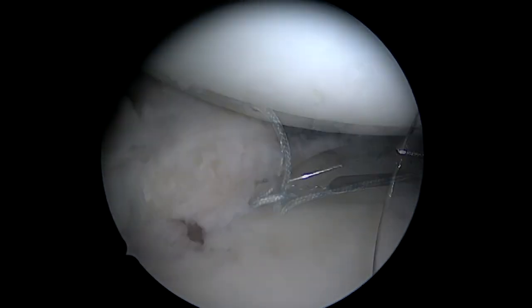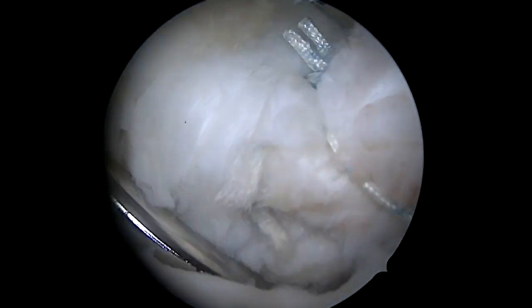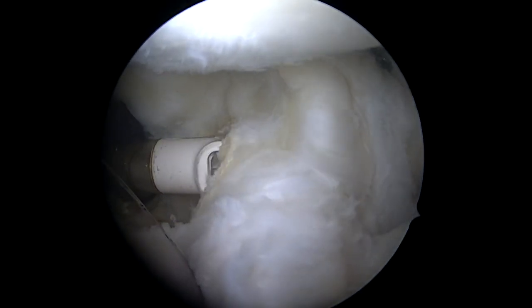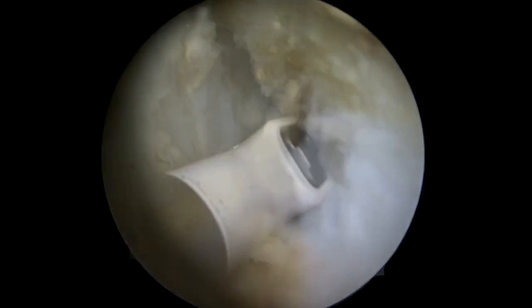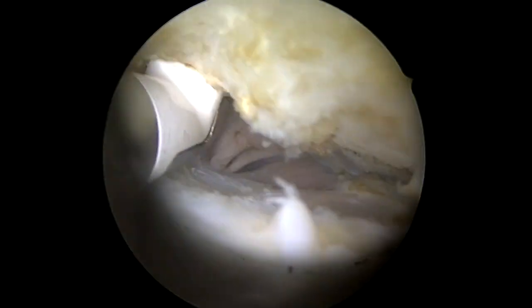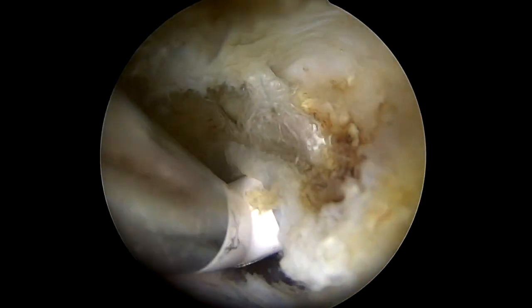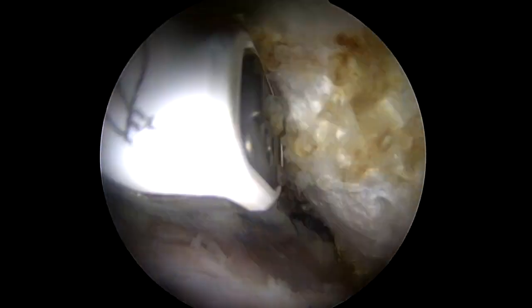Now we're at a level where you can see the actual fragment. We're going to isolate a space between the subscapularis and the capsule along the neck of the glenoid — above the anterior inferior glenohumeral ligaments — working through this window to find the anterior aspect of the piece. Here we are on the anterior glenohumeral neck; that's the piece itself, and you can see how mobile it is.